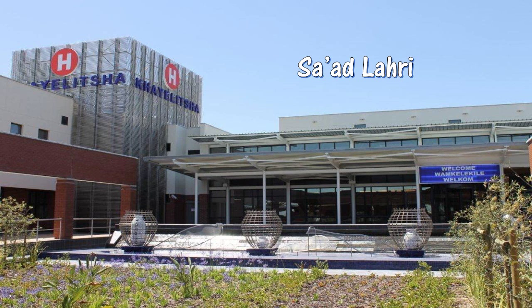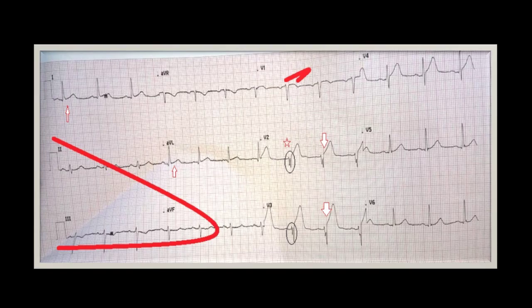Let's go through the ECG. If you have a look at lead 1 and AVL, you will notice that there is a current of injury. You can see here there is a high lateral myocardial infarction.